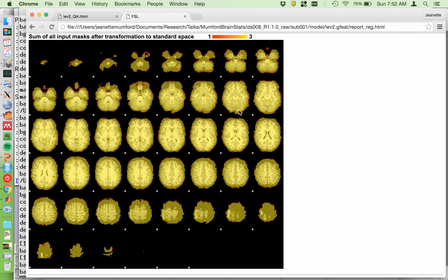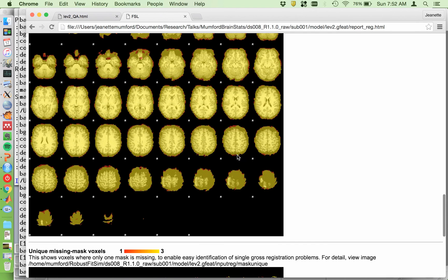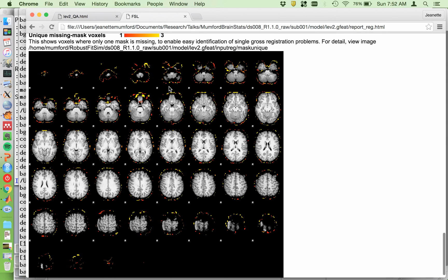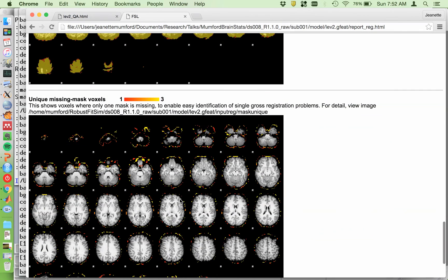People will also say 'we didn't see activation in this region of the brain,' but if that region was left out because you had signal dropout for one subject or something was off, then that's really misleading. So you want to make sure this is all yellow. If you see any red, that's not going to be included. This second image shows where only one mask is missing — you don't want any colors over the brain. Just along the edges is fine because we'd expect some discrepancies near the edges. These are the only two summary images we need to look at from this level. Typically the design matrix is so simple — just a column of ones — there's no reason to inspect it.